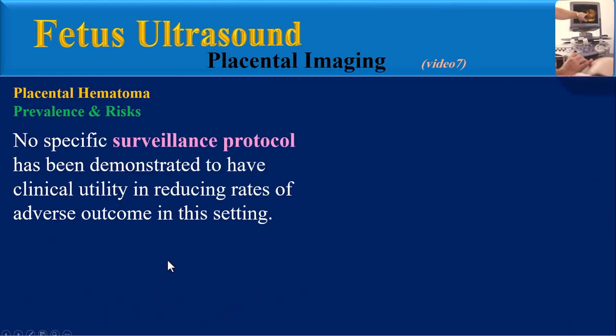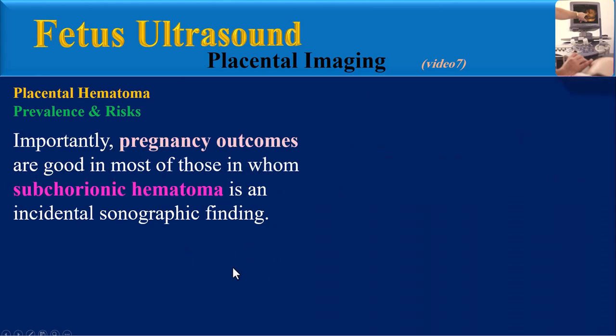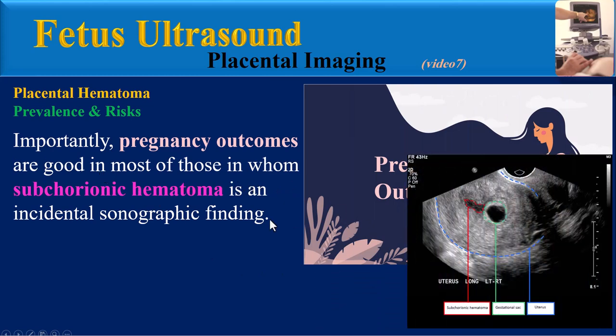No specific surveillance protocol has been demonstrated to have clinical utility in reducing rates of adverse outcome in this setting. Importantly, pregnancy outcomes are good in most of those in whom subchorionic hematoma is an incidental sonographic finding.